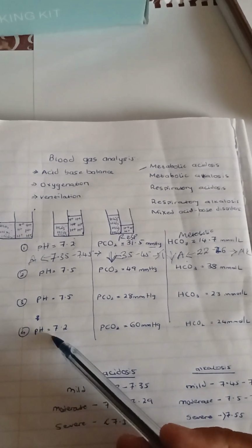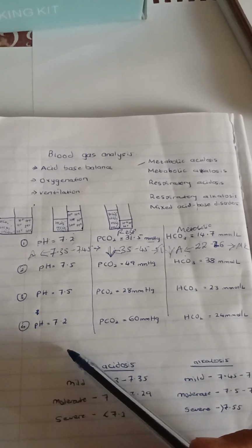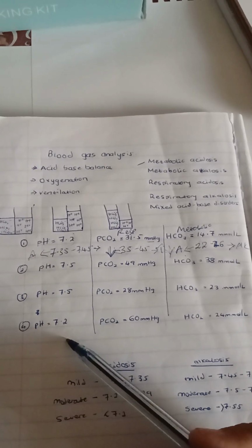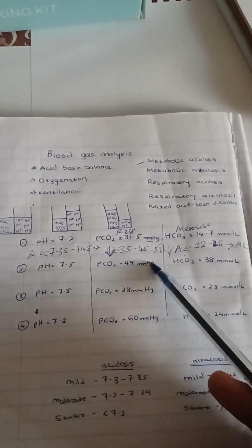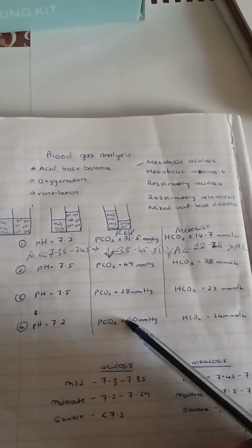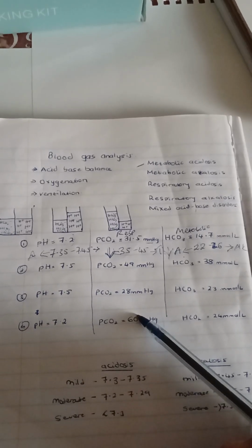In the last case, pH is 7.2. That's acidic, acidosis, less than 7.35. The second question, respiratory or metabolic. Now PCO2 is more than 45. So PCO2 is higher than normal, meaning more hydrogen ions. It means this is the one that's causing the acidosis.